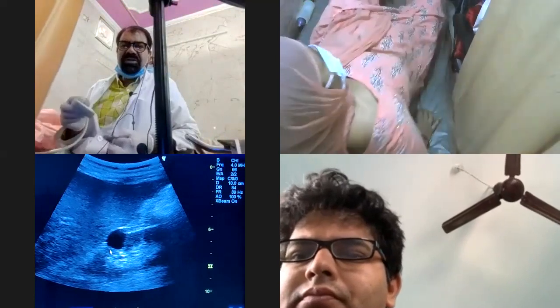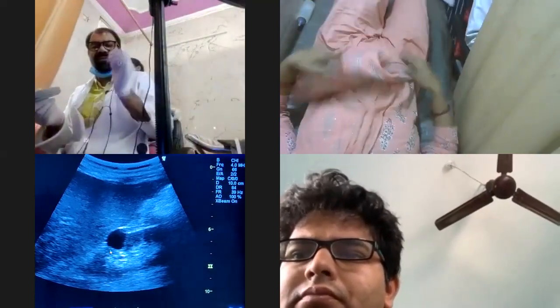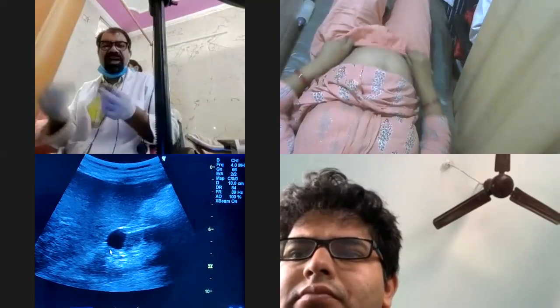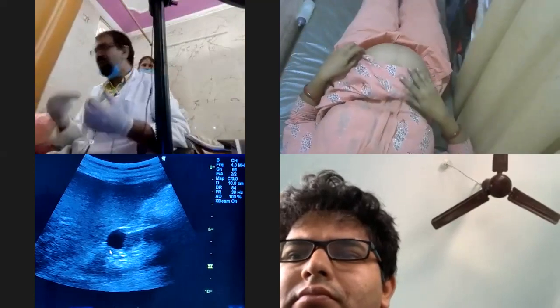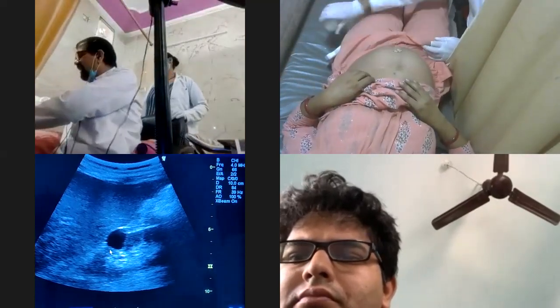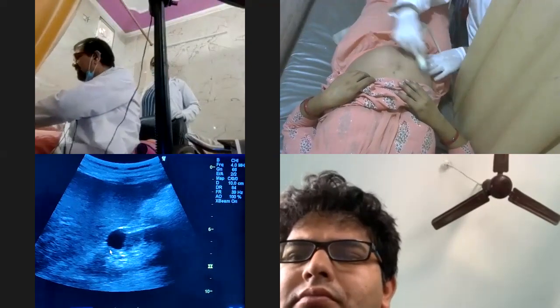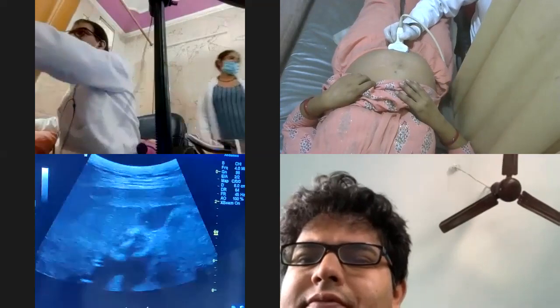Now, some of you may be comfortable with writing with left hand. Why should I force them to write with right hand? Now, I don't know whether you are lefty or you are a righty. On ultrasound, that will be decided by your rotation of the probe. So now quickly going through the patient.